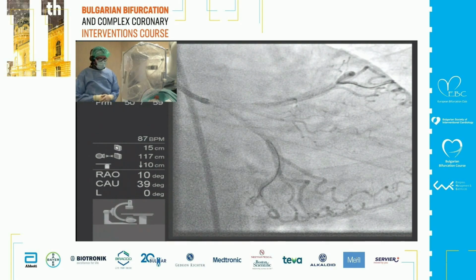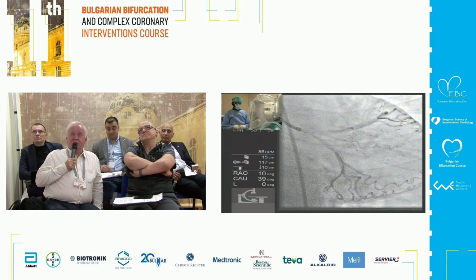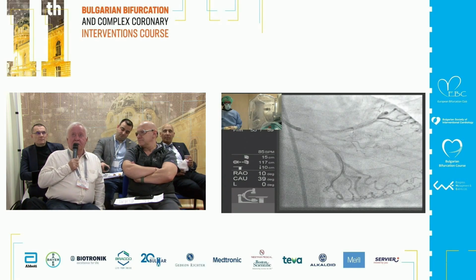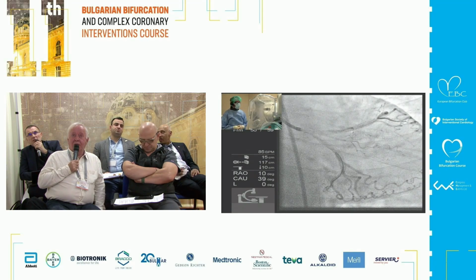So Dobrin is asking for IVUS. Personally, this is a provocation. This is what I will do, seriously. I will stent directly. Is it a 6 French or 7 French? Seven. 7 French.